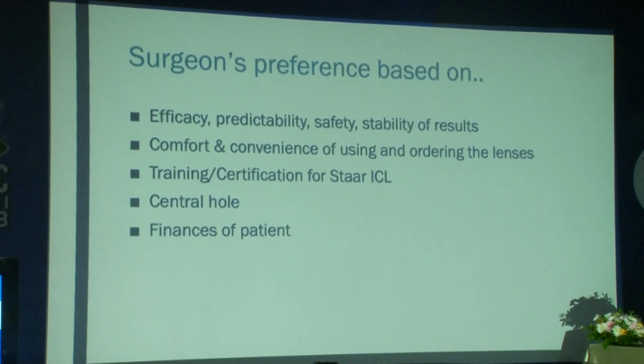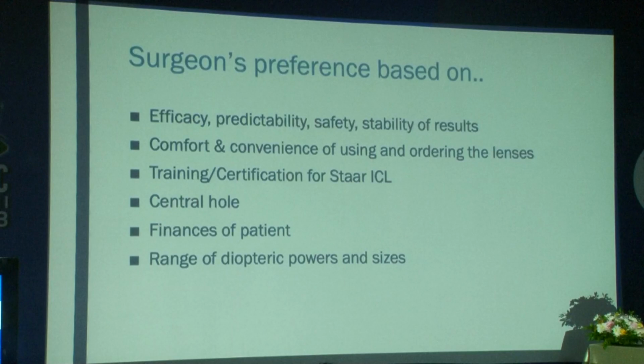Another determining factor could be the affordability of the patient, but sometimes you also need to base your choice on the range of powers and sizes that are available and provided to you.